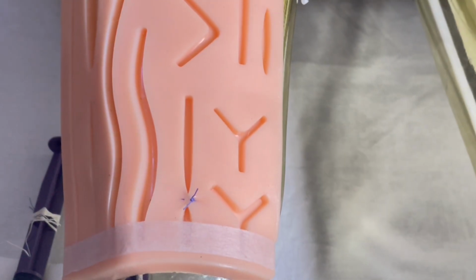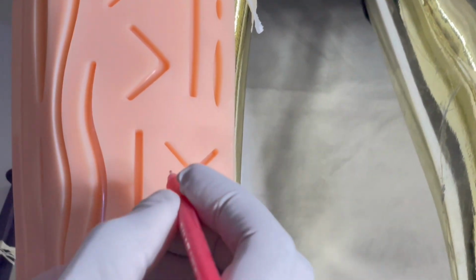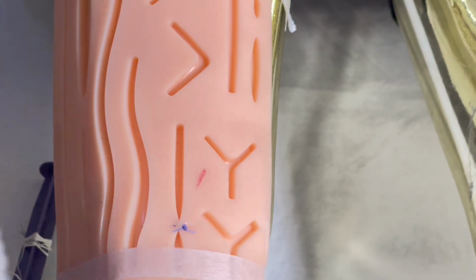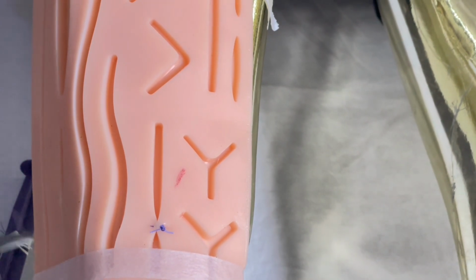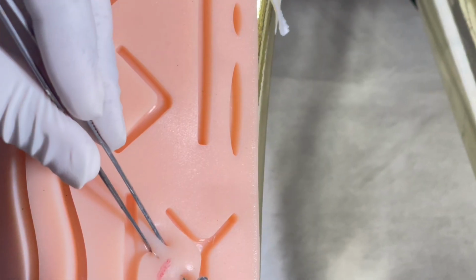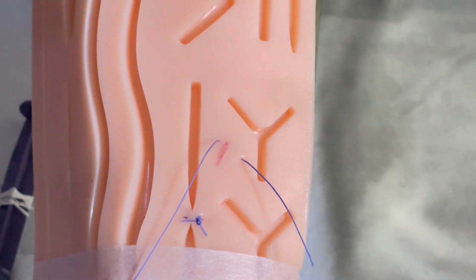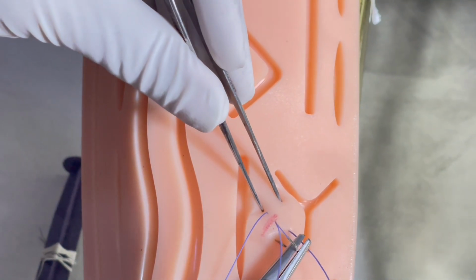In this manner there are different things. Now suppose this is a bleeding point, I will just demonstrate suturing. If a bleeding point is given, this is the bleeder, and you have to stop it, then what I have to do is take a simple suture in this manner. First, then a running suture.